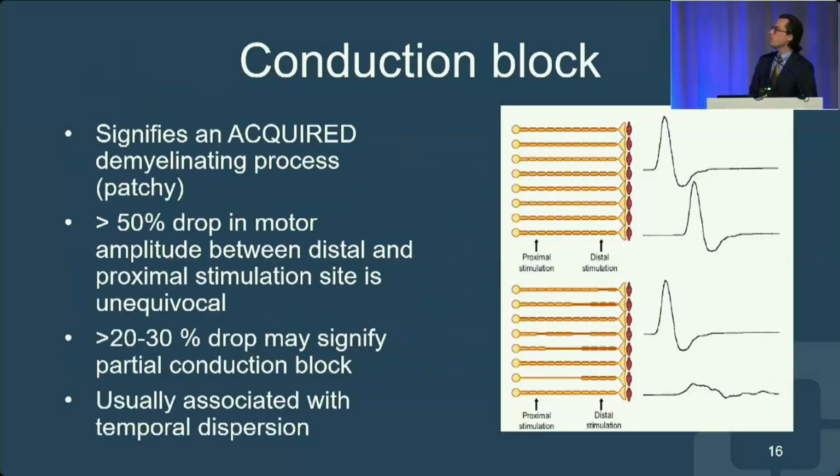So conduction block, yeah, of course. Maybe you're going to show this, but could you discuss timing of the nerve conduction studies relative to the symptoms? Sure.